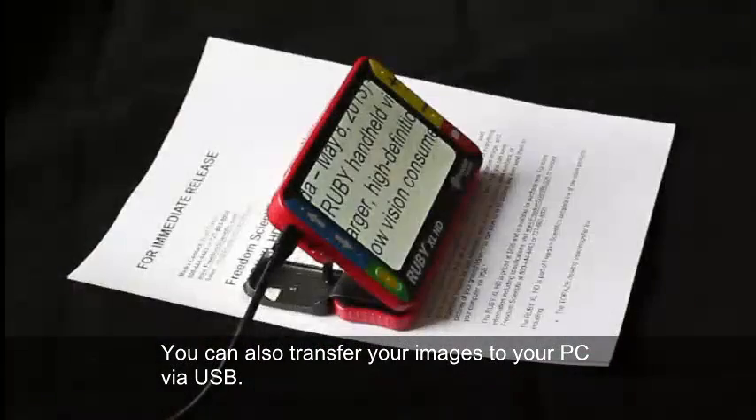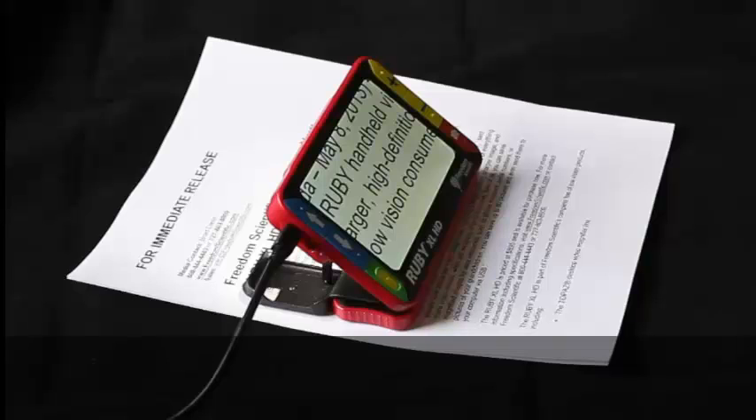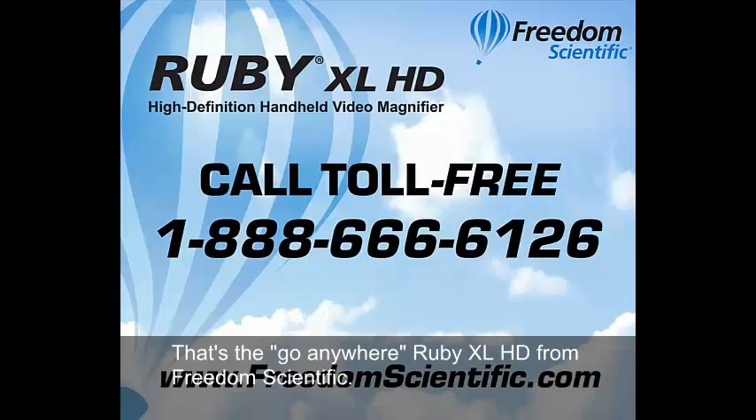You can also transfer your images to your PC via USB. That's the Go Anywhere Ruby XL HD from Freedom Scientific.